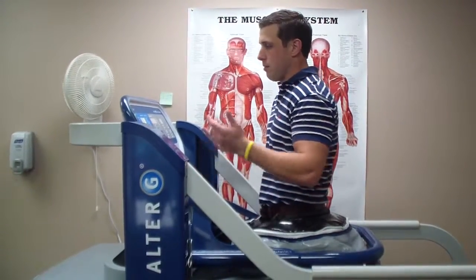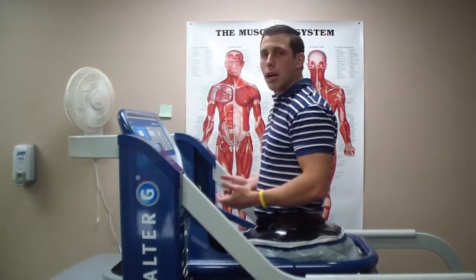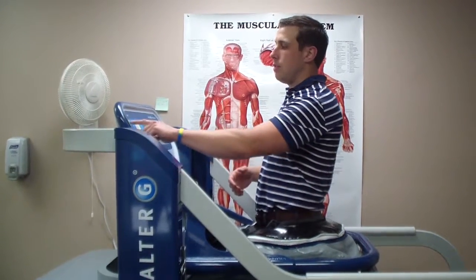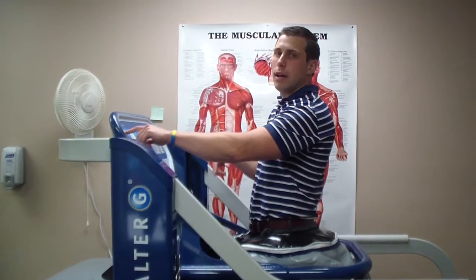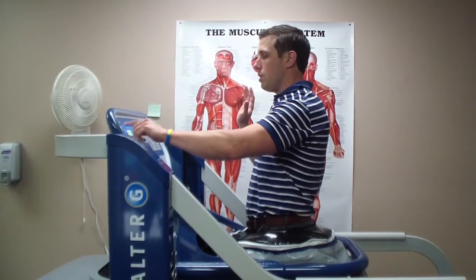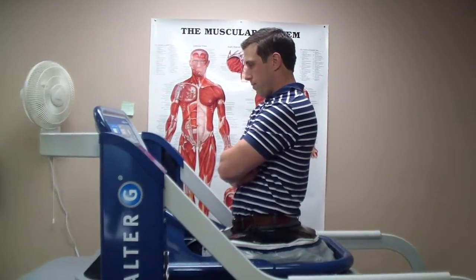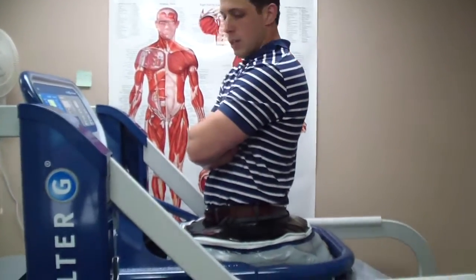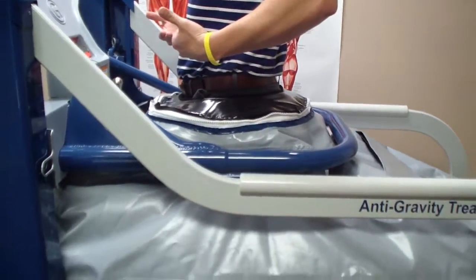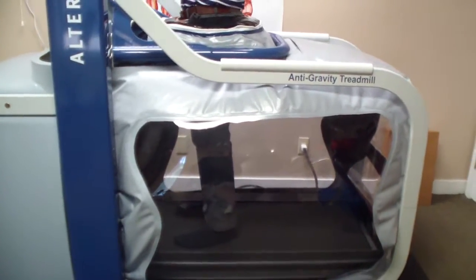We usually clip this on. First step: you press the start button. It calibrates to your body weight in order to take the correct percentage off. It gets a little loud — there's a little bit of fan noise. Hands are always up, and then the bag will inflate. The shorts lift up on your body, and that's how you remove the weight.